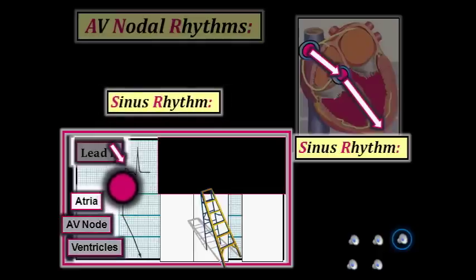Rapid conduction through the atrial tier, with fast conduction schematically drawn as a vertical blue line, slower conduction through the AV node, represented by this blue line drawn in at an angle, and then rapid conduction through the ventricles. Note, although we added in 2 red circles to represent the SA node and the AV node, these are typically omitted on an actual laddergram.